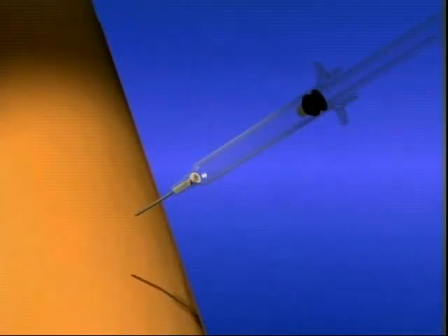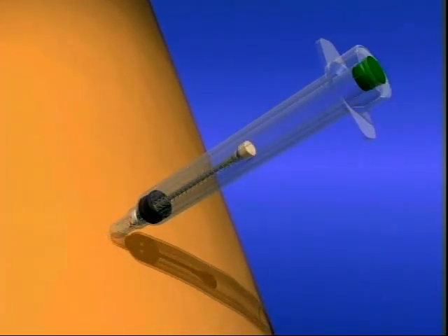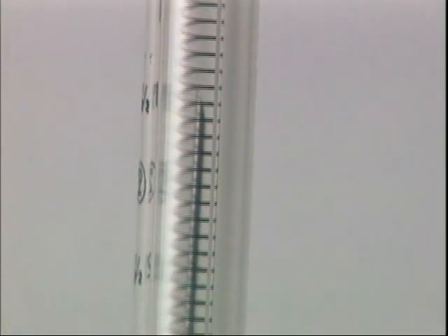In one easy step, the needle is automatically retracted directly from the patient, preventing exposure to the contaminated needle and virtually eliminating the risk of a needle stick injury. Once activated, the retracted needle can be seen inside the barrel of the syringe.